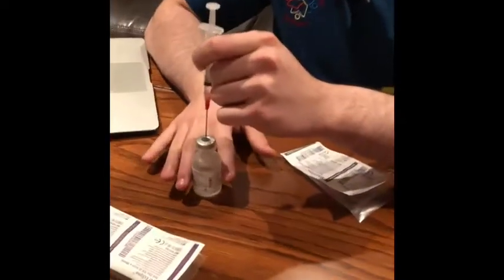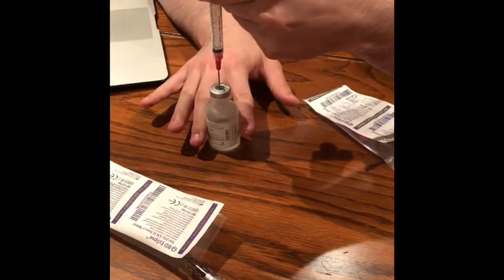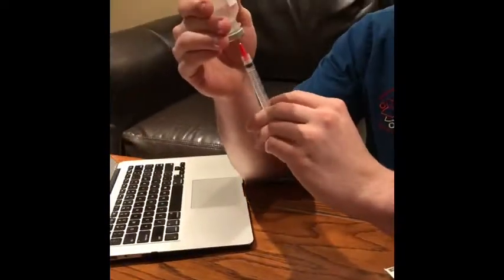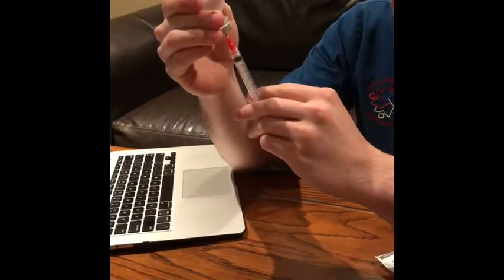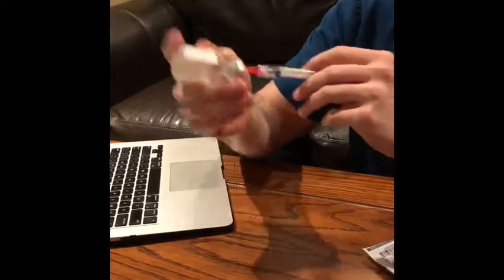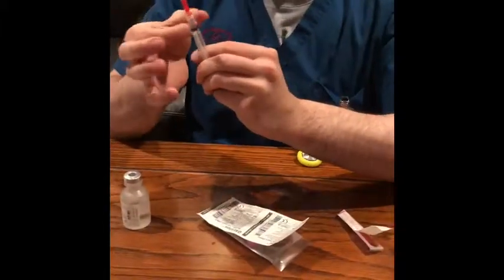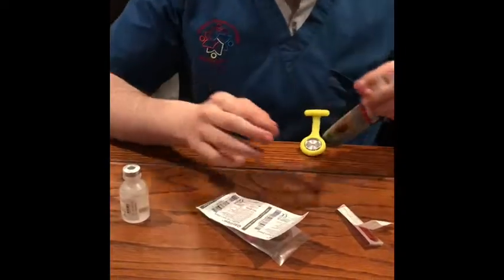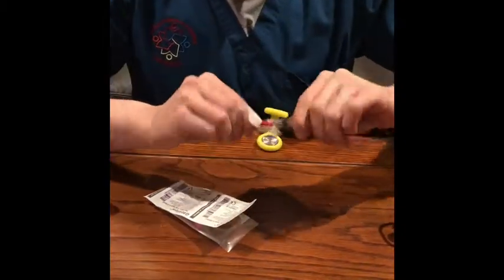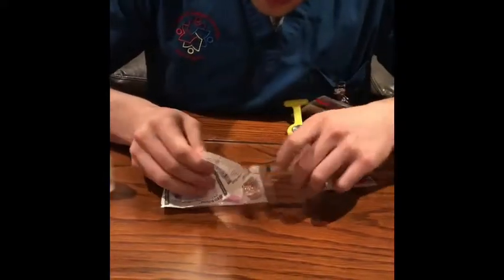And now I'll be pressing this in air while supporting it with my non-dominant hand, and then drawing up the medication and submerging it to draw back the required 1 milliliter. And then there's some air in there. Perfect. Then I can put the filtration tip back, and then I will apply the intramuscular tip to this needle.